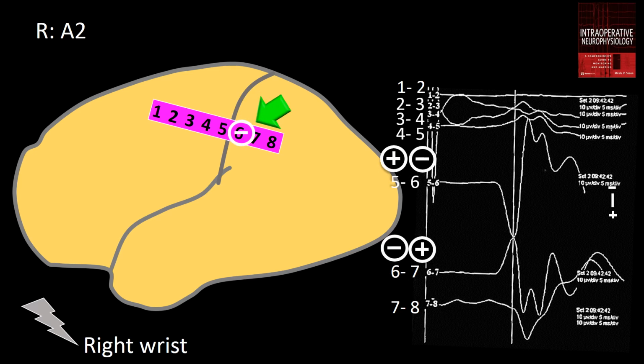This can be confirmed by the phase reversal in the bipolar montage. Remember that phase reversal found in bipolar montages are often referred as false phase reversal, since what they indicate is the highest amplitude of the field and not the presence of a dipole.